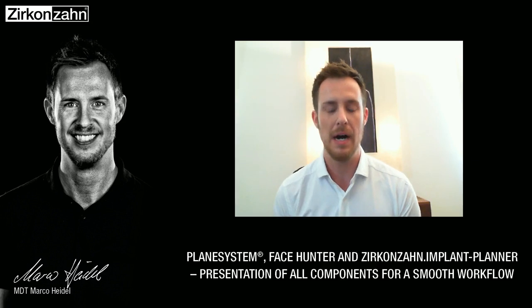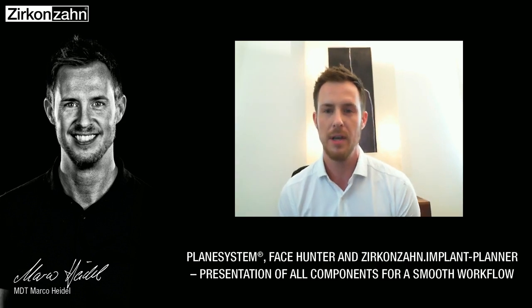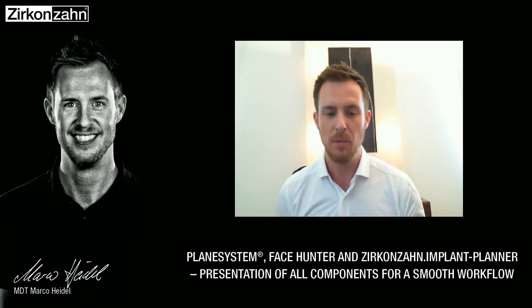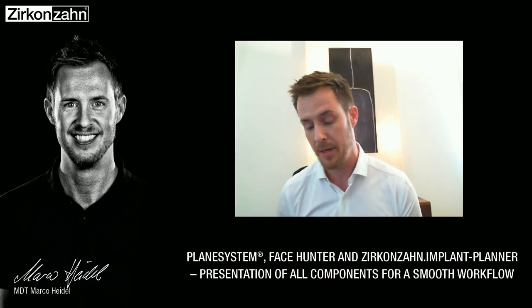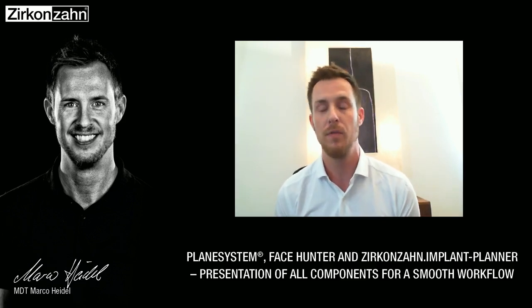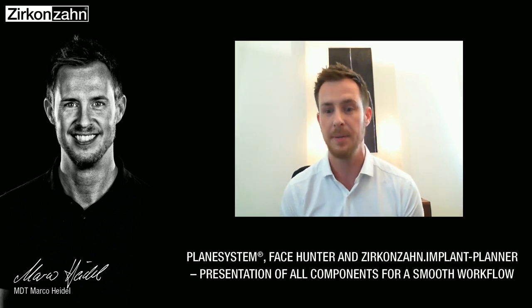My name is Marco. I'm a master dental technician working at Zirkonzahn for around 5 years, and I'm in charge of the external trainings for our customers and also for a lot of research and trials on real patient cases as well. One of the parts I tried the last time is the immediate loading workflow, or a smart immediate loading workflow. This new technology and workflow I want to present to you today in combination with Dr. Holger Meiser from America.